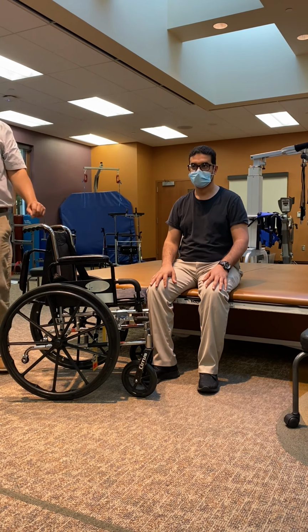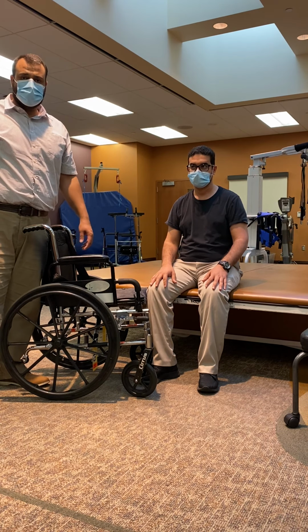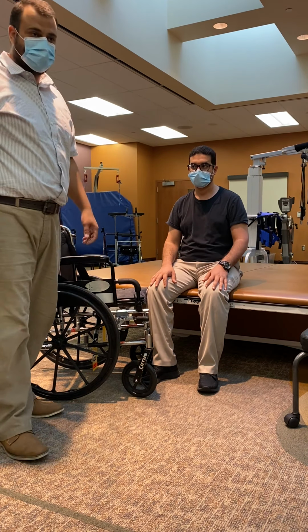So this transfer can be done in two ways, standing or sitting. And always we train our patient to transfer toward the strong side and toward the affected side. So with this patient, we can get him to the wheelchair, which is the strong side, then get him back to the mat, which is the weak side transfer. So I'll do it first in standing.